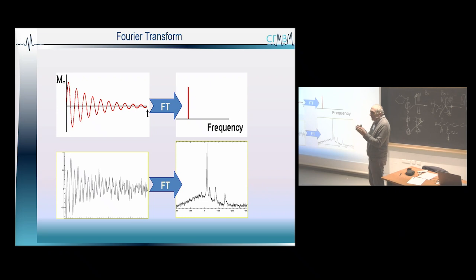You're right. If we were able to be selective enough to get only one frequency, but actually we are using frequency pulses that are exciting a kind of band, and that's why with a single pulse, we are able to excite all the bandwidths.